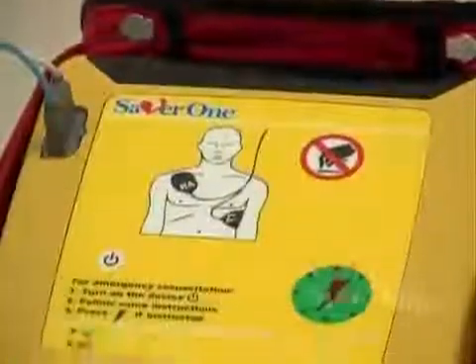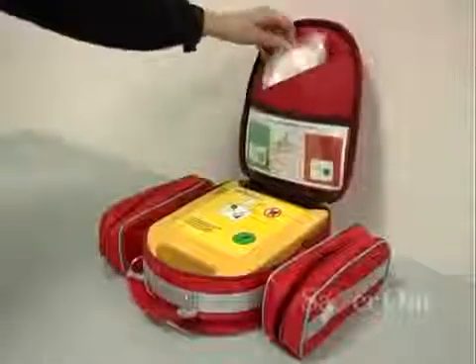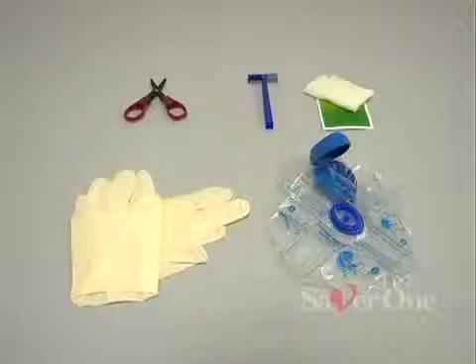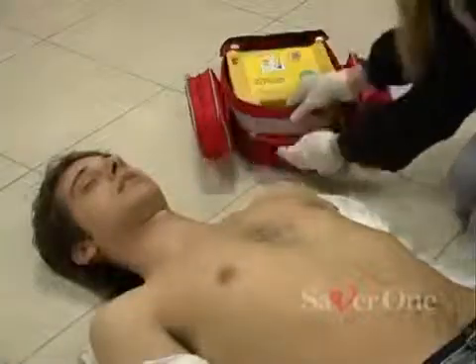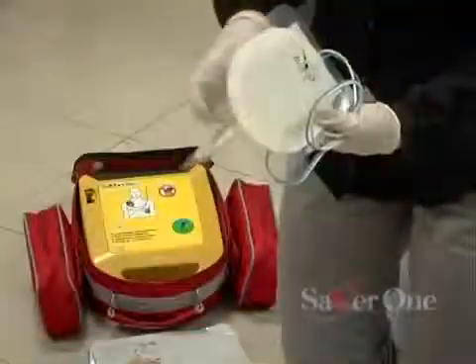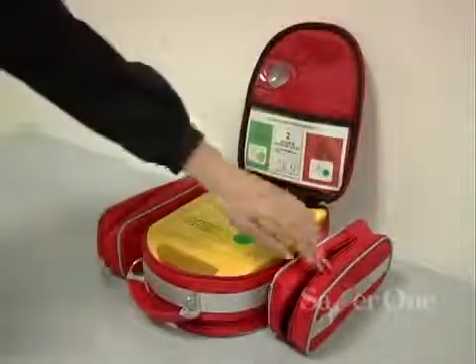The main steps of the use of the Saber One: behind the quick reference card in a pocket is the patient's preparation set consisting of scissors, razor, napkin, gloves and disposable mask. The electrodes are in the back pocket of the bag. Spare batteries can be stored in the side pockets.